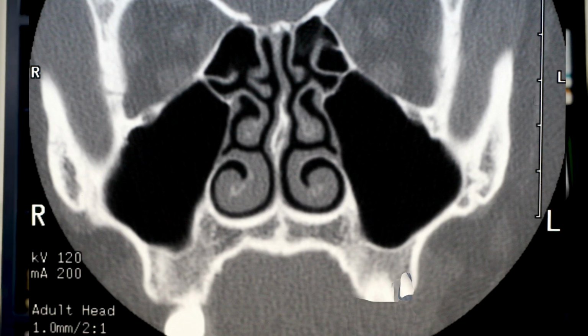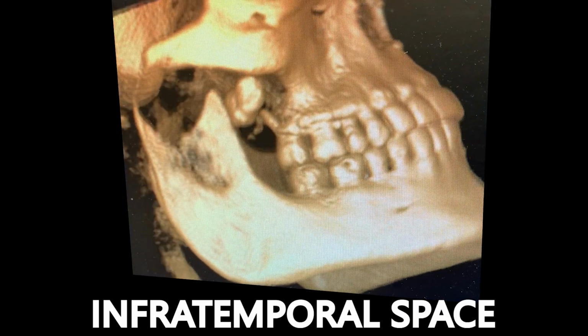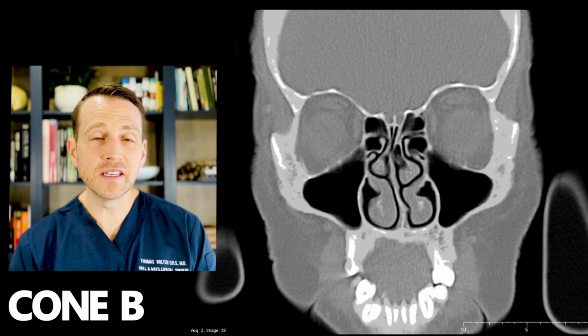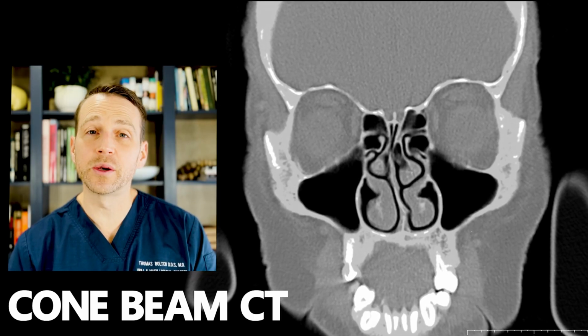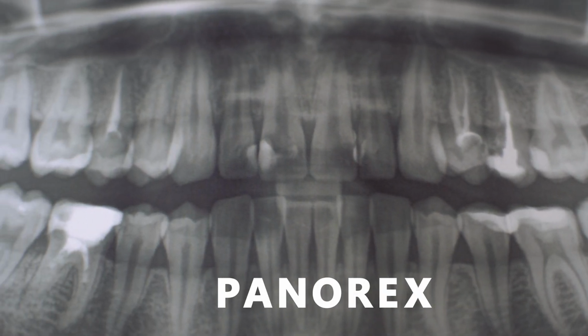First, it's critical to confirm that the root is actually in the maxillary sinus. It's not hard to push roots through a thin buccal plate into the subperiosteal region adjacent to the alveolar bone. Maxillary second bicuspids and first and second molars are most likely to fall into the sinus, but maxillary third molars can potentially fall into the infratemporal space, which is a completely separate problem that I address in different videos. Check out the channel. Cone beam CTs are the ideal imaging modality and will accurately display where the root is sitting. A Panorex is a distant second, but at least it will help.